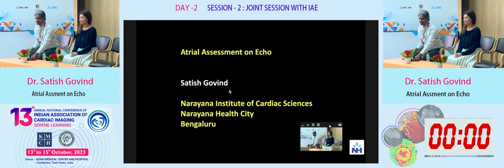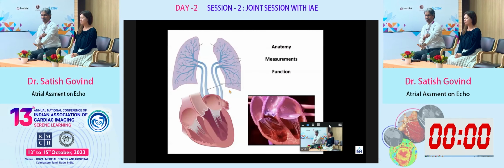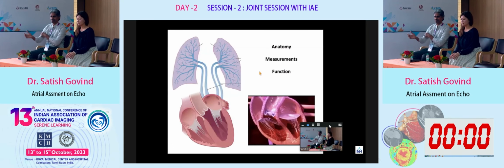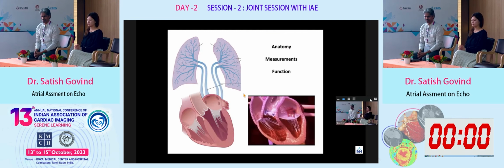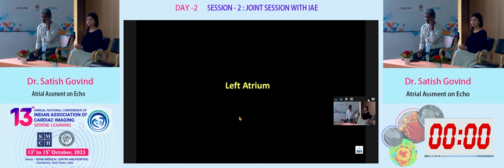So I know it's lunchtime and behind schedule, so I'll try to finish as fast as possible. This is about the atria and echo. Typically when we are looking at the atria, we are looking at anatomy, measurements, and function. So let us see how we look at it from the echo perspective.